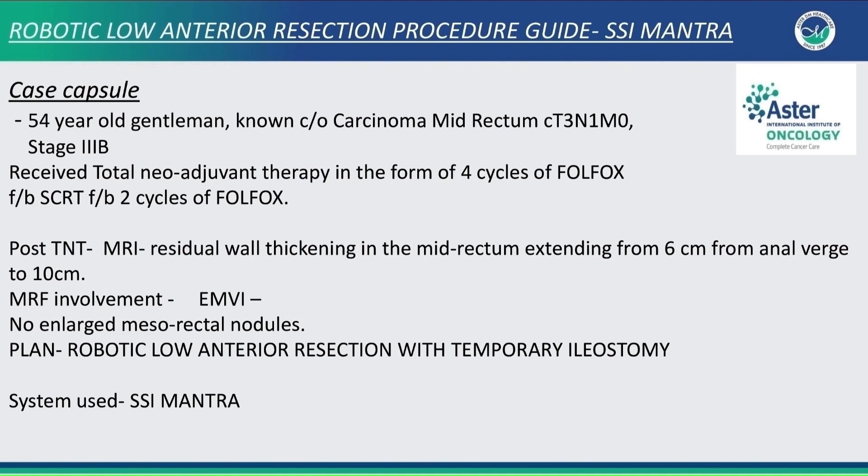This is a 54-year-old gentleman with carcinoma of the mid rectum. After total neoadjuvant therapy, we had planned the patient for robotic low anterior resection using the SSI Mantra.